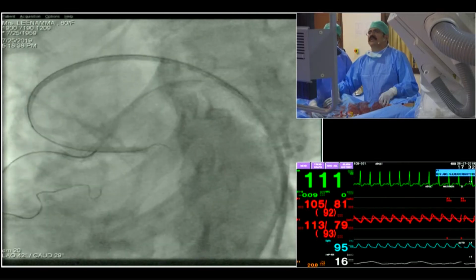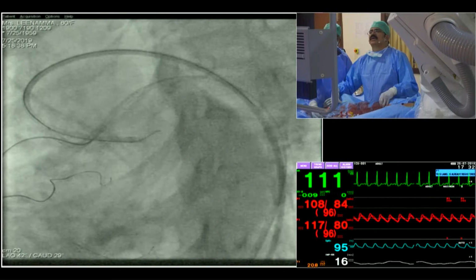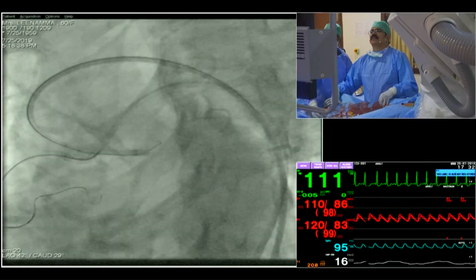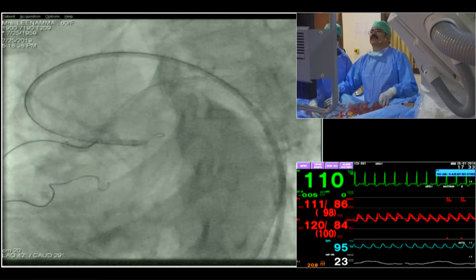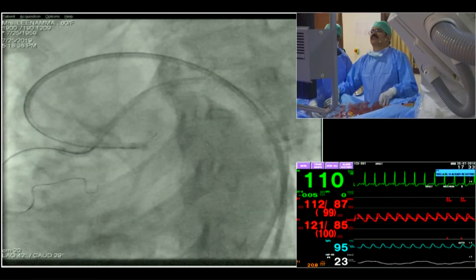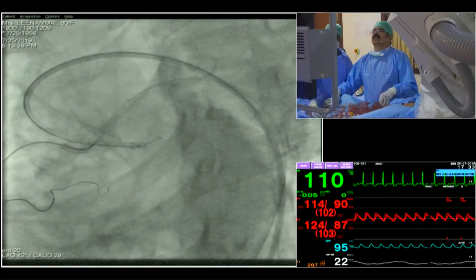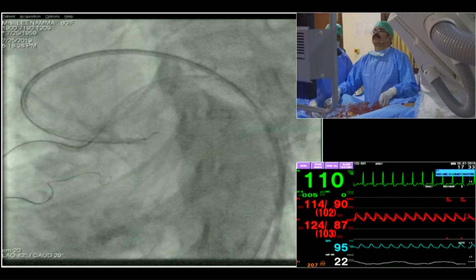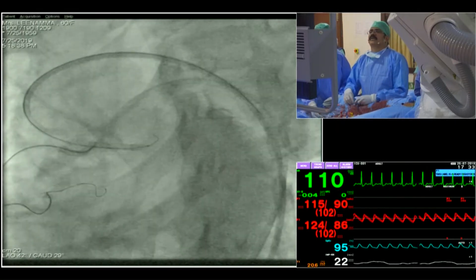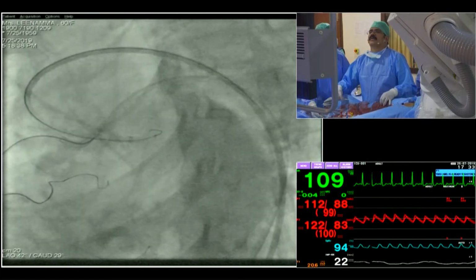Okay. See, the wire is not sitting there. I'm actually pushing my microcatheter so that even if I wanted to take a tougher wire, I can take it with that. This is actually one of the limitations of the Fielder wires, because they are very slippery, lubricious, but the torquability is not good. They have been created actually to navigate into microchannels. Yes. So when you have bends, they are actually in trouble.